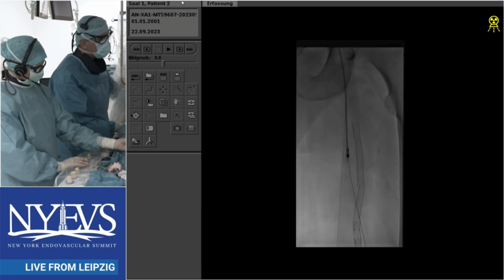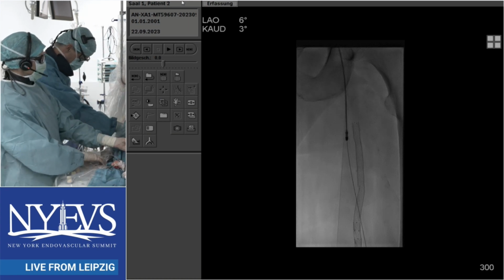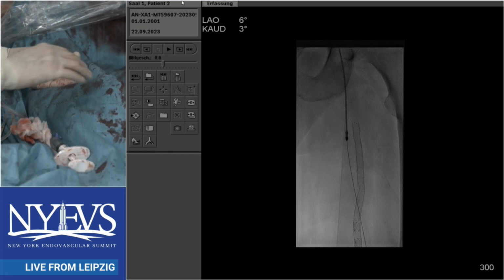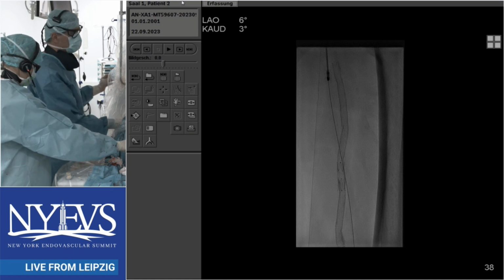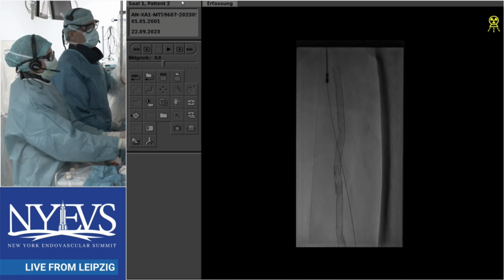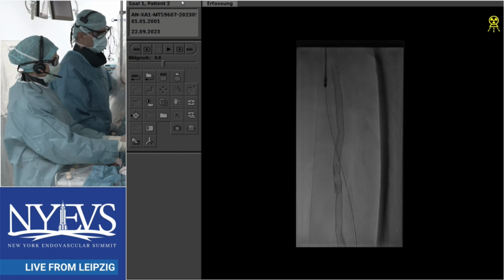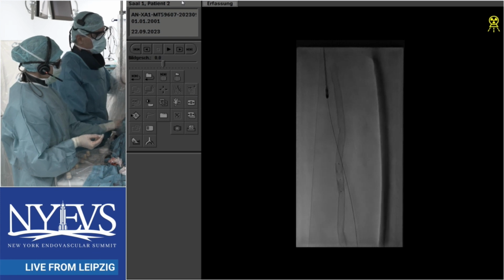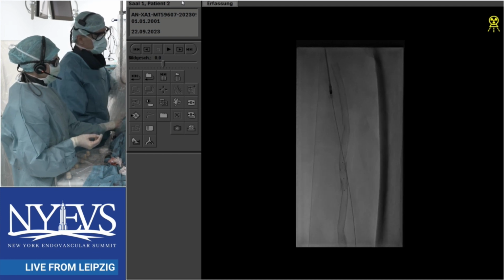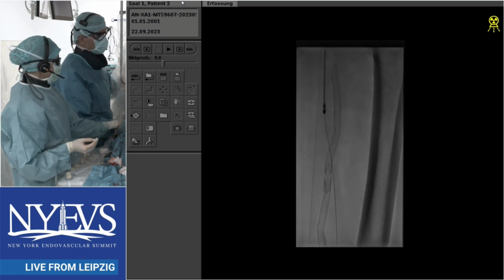Andre, can you tell us your algorithm? I've noticed over the years you've actually done quite a few passes with the device when you've used Rotarex. Do you have an algorithm in your head in terms of how many passes you need to make? Is it a feel thing? What are you looking at or thinking about? It's a few things. In fact, we're doing one extensive passage like this here, going a little bit back and forth. And then we take it out and we have a look. And if we see areas with more thrombotic material left, we go in once again, but not for the whole area once again.